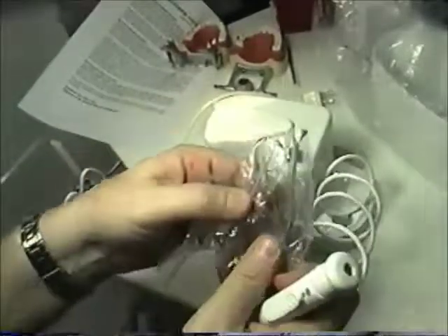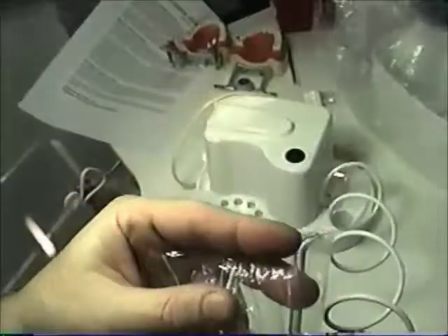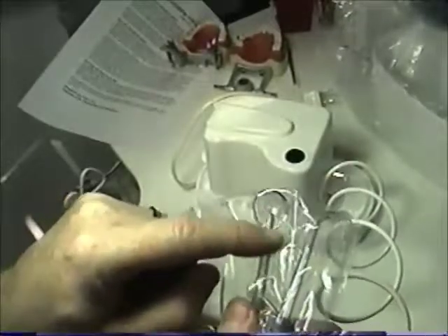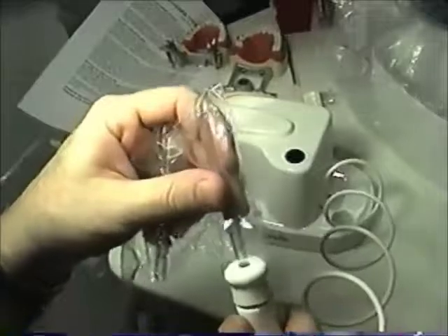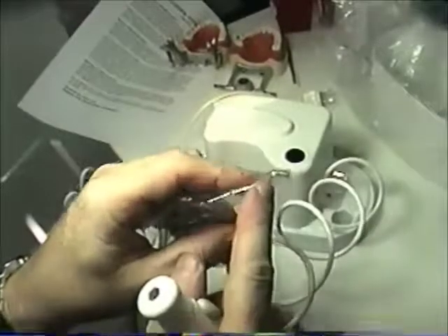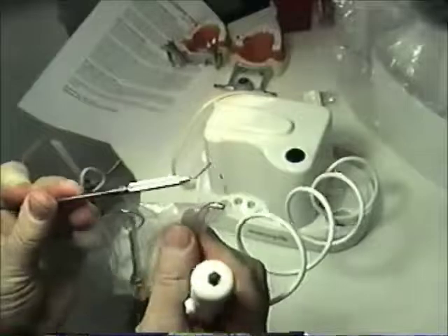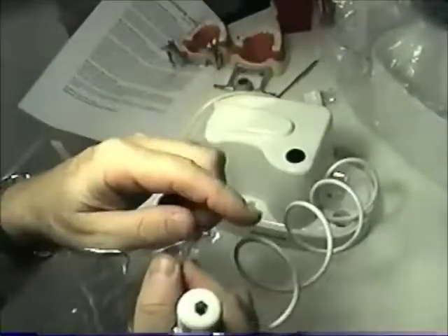But basically, this comes with two tips. It comes with this real fine little sickle tip. This is the main one you want to use. This other one I have not found to be that useful, that has this other, looks like a spoon effect. But basically this plugs into the top of this and snaps in, and the water comes out of this tip at a very, very fine stream equivalent to this probe, so that you can actually pretend the stream that comes out of here is the probe.